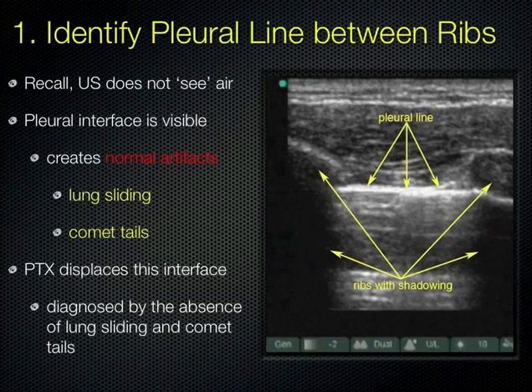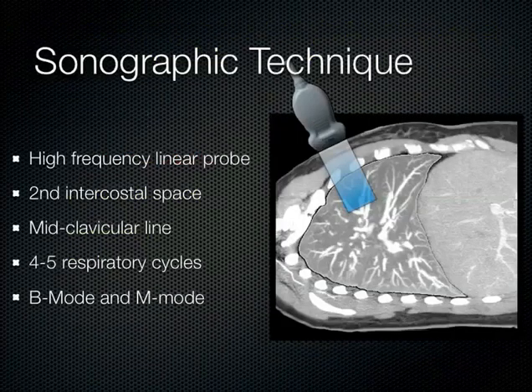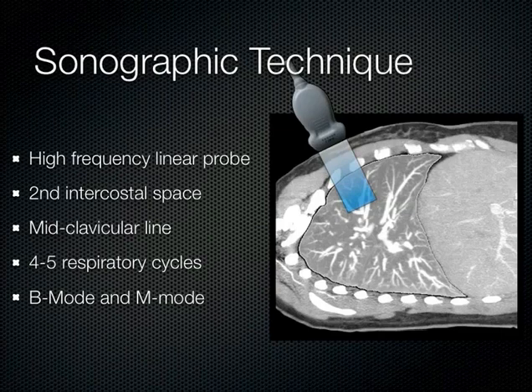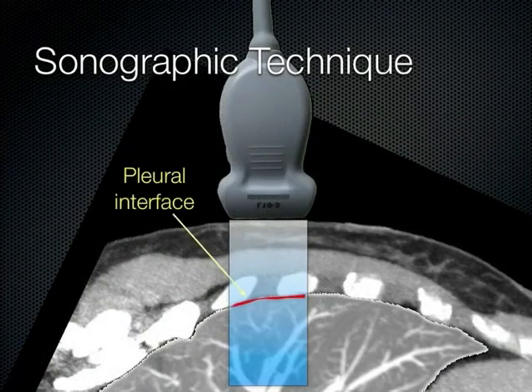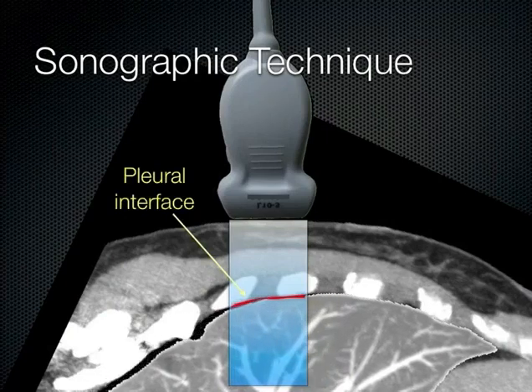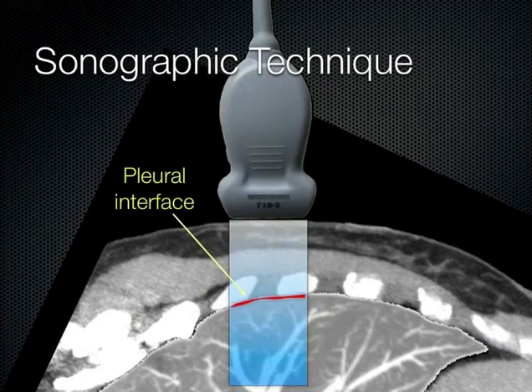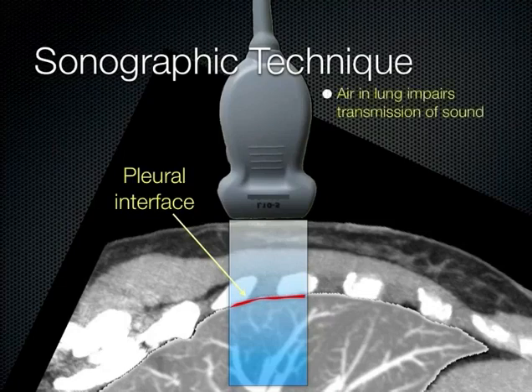Using the high-frequency probe in a craniocaudal sagittal orientation, starting at the second intercostal space at the mid-clavicular line, watch through several modes of breathing. You're looking for the lung to slide back and forth. The lung moves craniocaudally, so the vertical orientation best captures it. Remember air impairs sound transmission — when the lung is up, you may see faint B-lines or A-lines, but you won't see deep into the lung. You should be able to see the pleural interface and sliding. If the lung has collapsed, it drops away and you cannot get your ultrasound beam through that pocket of air.